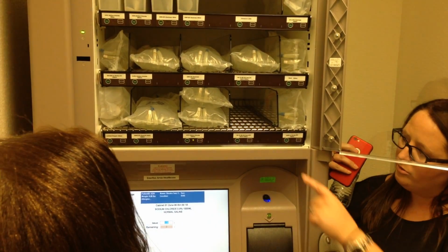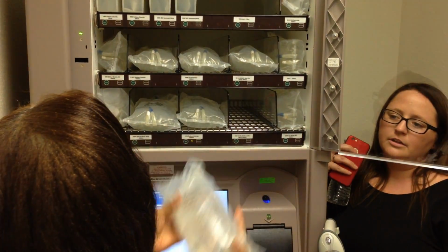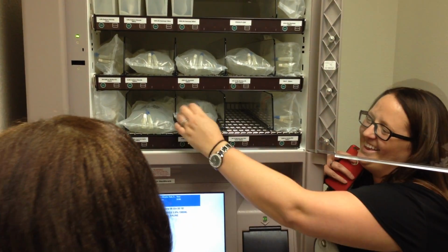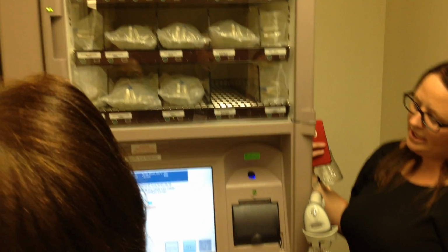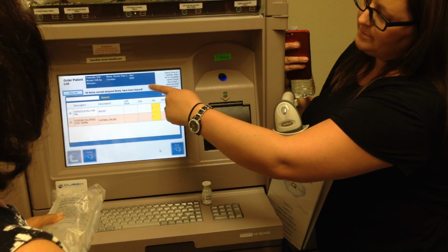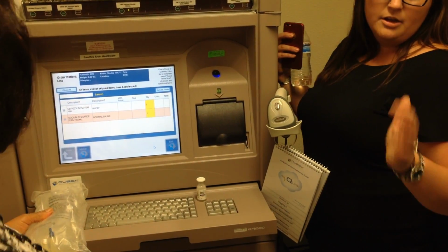Okay, so you'll take one out. It says if you take one out, there's 2 left, and there really is. Okay, and then you can close this and watch your head, and make sure you get it closed all the way. Perfect, just like that, and then you'll hit next. And it'll say all items have been issued except whatever you skipped, and then you're done. You'll hit exit before you leave. The most important part, hit exit before you leave.